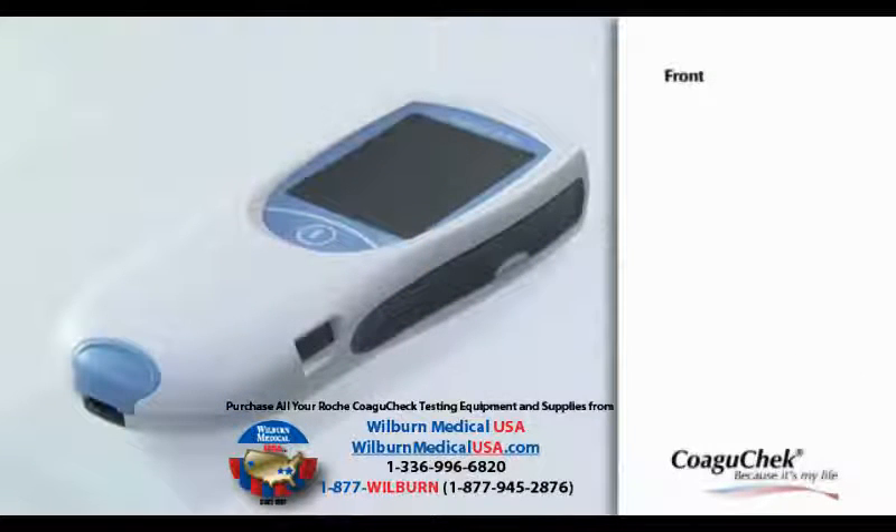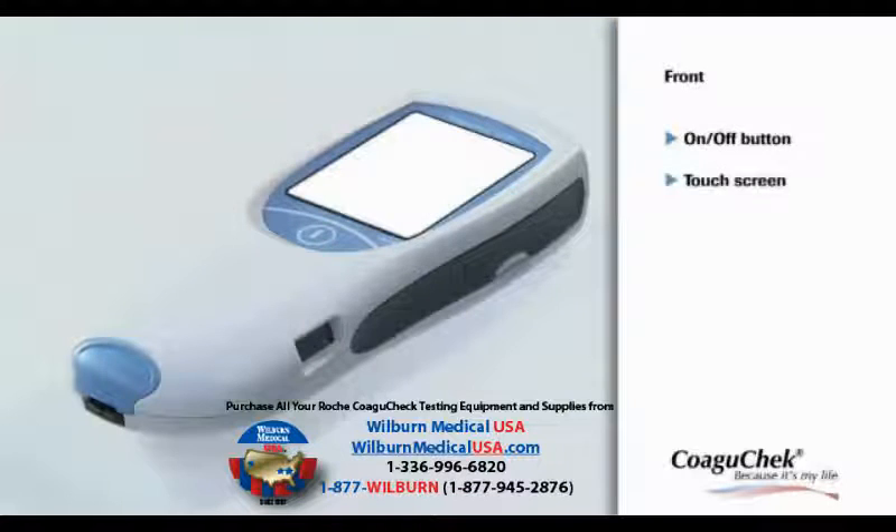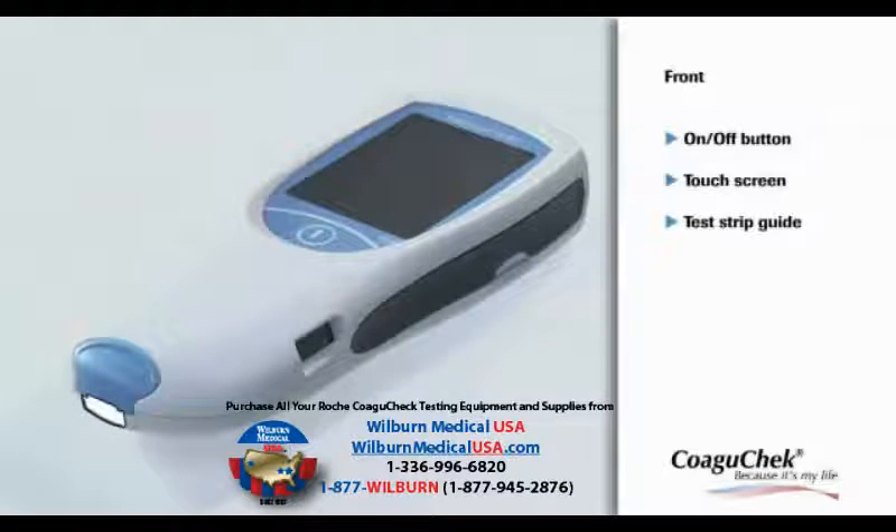Let's have a look at the front of the meter. Press the On-Off button to turn the meter on or off. The touchscreen makes the meter very easy to operate. Test strips can be inserted into the test strip guide below the measurement chamber cover.